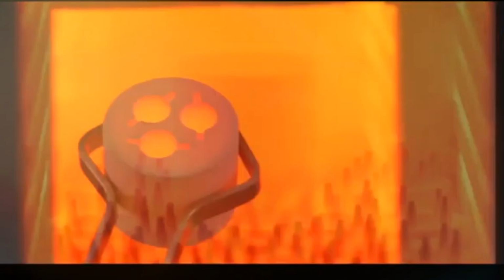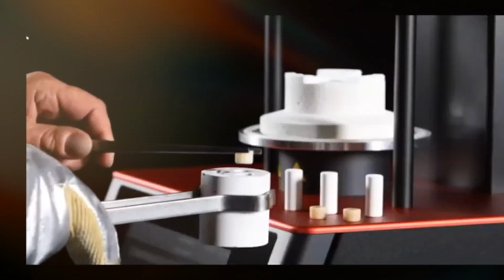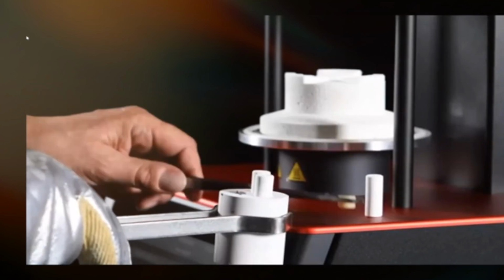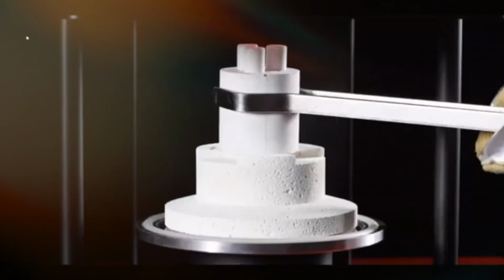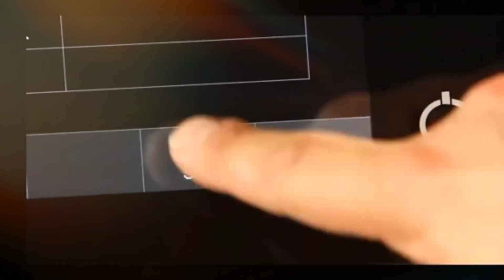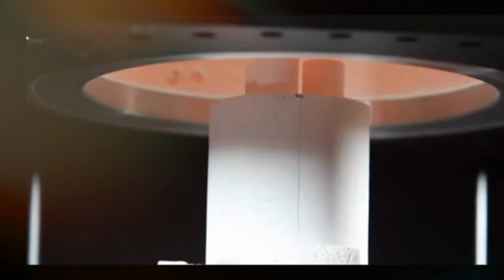After at least 1 hour, we get it out, and then we put the ingots. We can combine 1, 2, or 3 different ingots at the same time, in the same pressing, and the press is simultaneous for all of them.